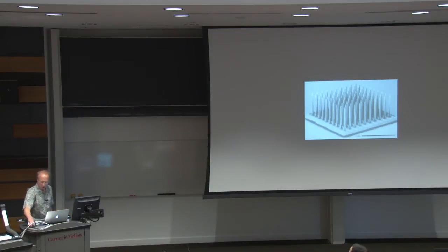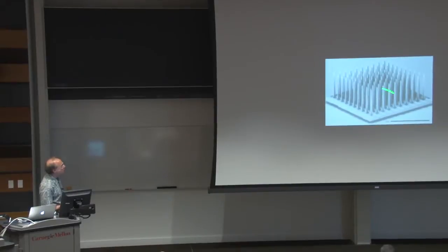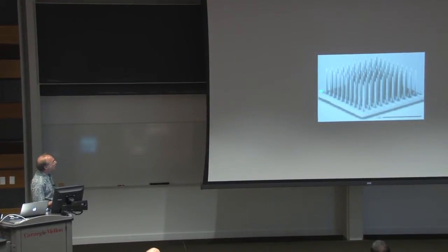Over the years, technology has been developed that allows us to do this. The electrode I'm going to use now is called the Utah Electrode Array. It's a 4x4 millimeter platform. This started out as a cube of silicon that was sawed in this pattern and then etched to form these icicles. These are about a millimeter and a half long. They're metallized at the tip with platinum, and there's conductors on the back. I'll show you that in a second.